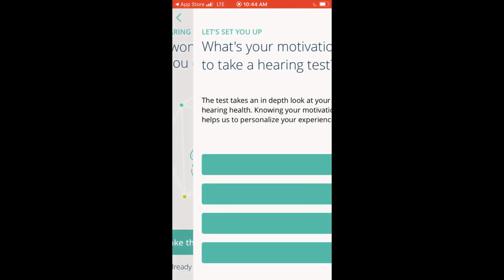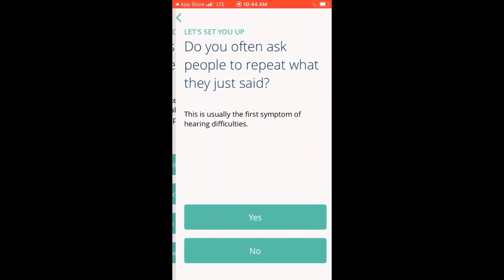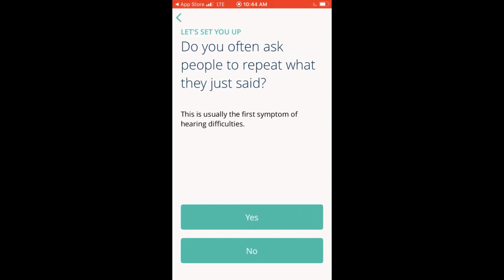And then here it's going to ask a couple questions. First, what's your motivation to take the hearing test? Go ahead and just put, I'm curious about my hearing, the first green button there. After that, it's going to ask you, do you often ask people to repeat what they just said? Either way, you can say yes, you can say no. I'm going to press no here.